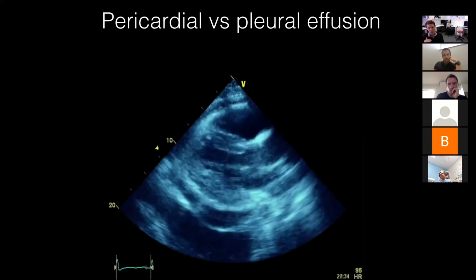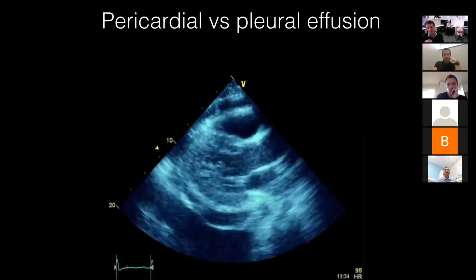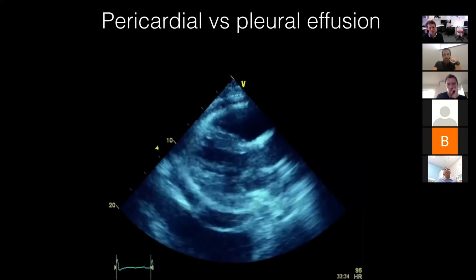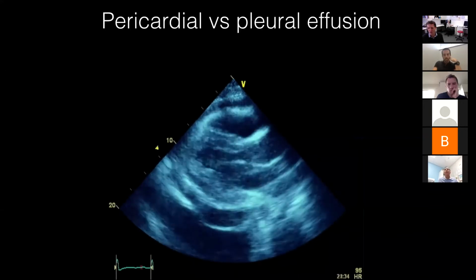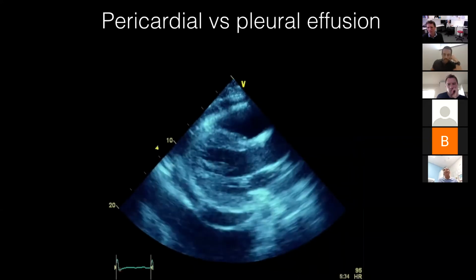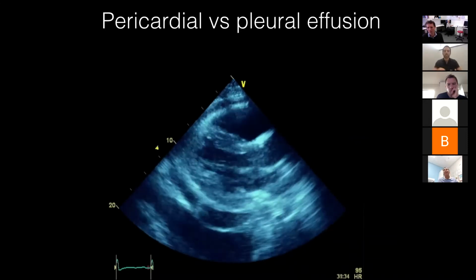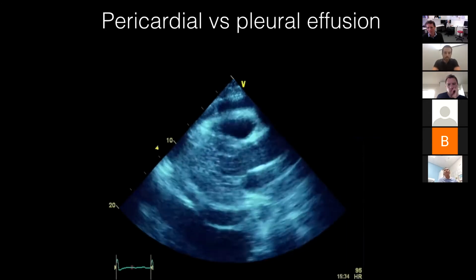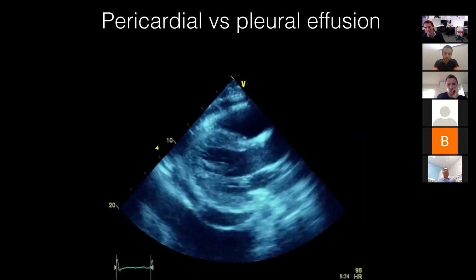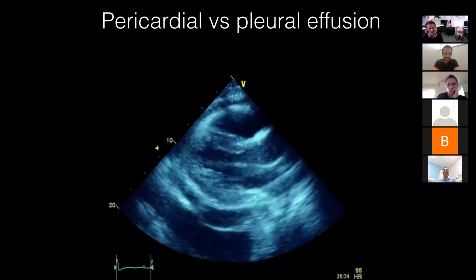Swapnil, are you up for a question, or do you want me to smash the echo fellow here? Only thing is I can't see the echo properly. It's very slow moving. Is it just my network? Sorry, is it working? Ben, up in Cairns, are you seeing these images okay? Yeah, I can see that fine. I'm sorry, it's not working brilliantly. I think it's my network. Are you in the hospital? It's pretty slow to me too. Sorry, it's a Sydney thing. It's better up in Cairns. Well, why don't we start? We'll ask Anne-Marie, our echo fellow.